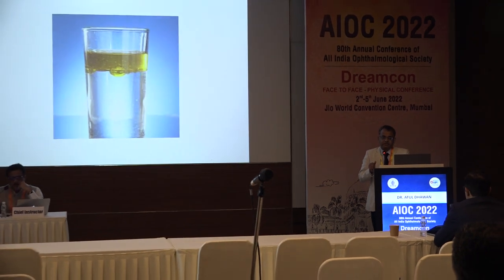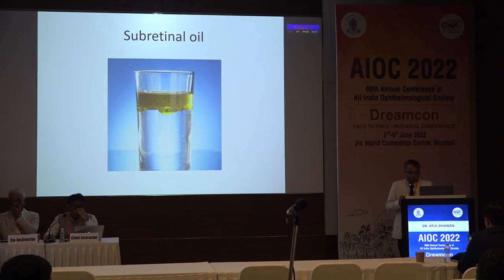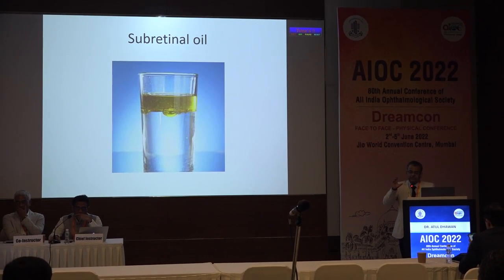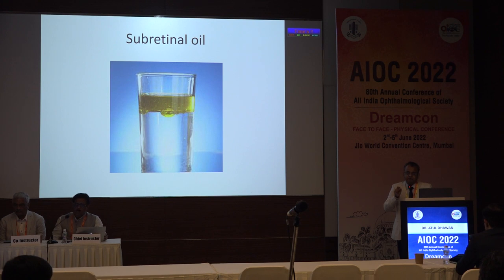Now, I have used two things. One is gravity. The second one is the immiscibility of oil and water molecules. So in a glass, if water is there, and oil is there, and you start pouring water inside the glass, then the oil will come up because it is less dense. I have used the same phenomenon in removing the oil from the subretinal space in the eye.